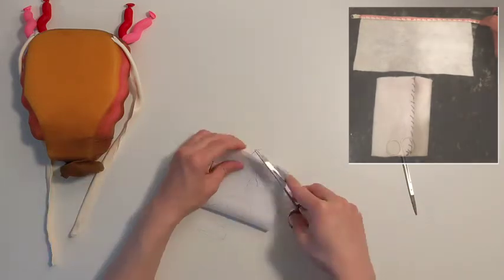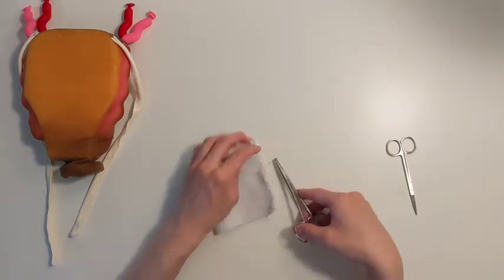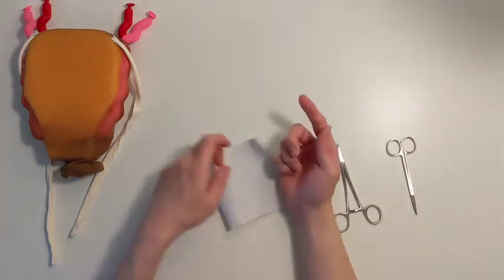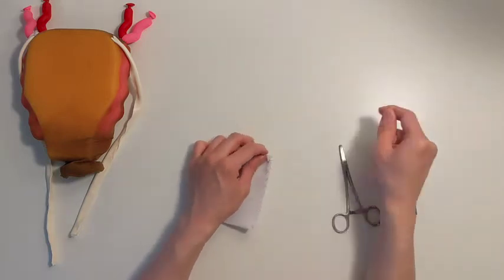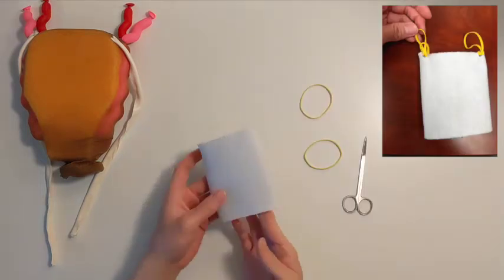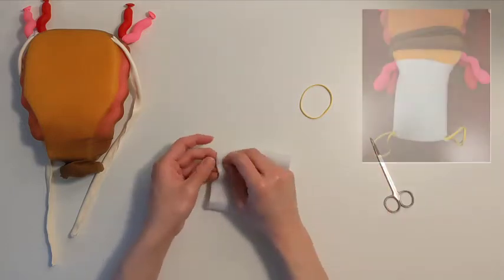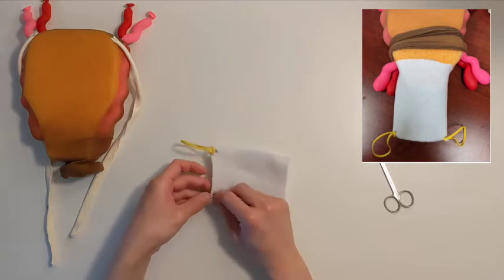In order to attach the model to the pelvic stand, rubber bands need to be attached to the vagina. To do this, cut 2 openings in the inferior portion of the vagina. Then thread a rubber band through as shown. Finally, with the knee highs rolled halfway up, fit the vagina over the trimmed portion of the uterus with the rubber bands facing anteriorly. The vagina should stay in place on its own if snug. To make it more secure, a piece of tape could be added or a figure-of-8 suture.